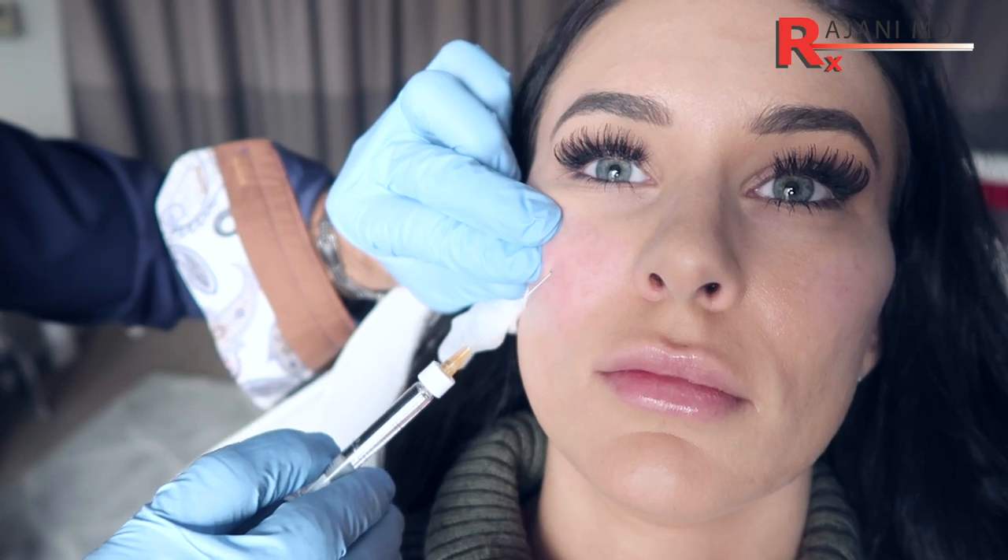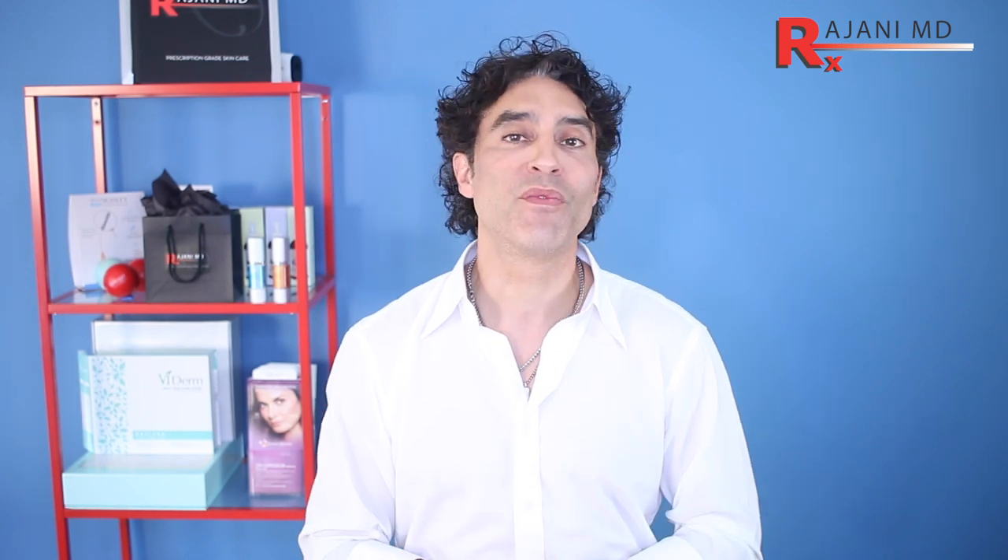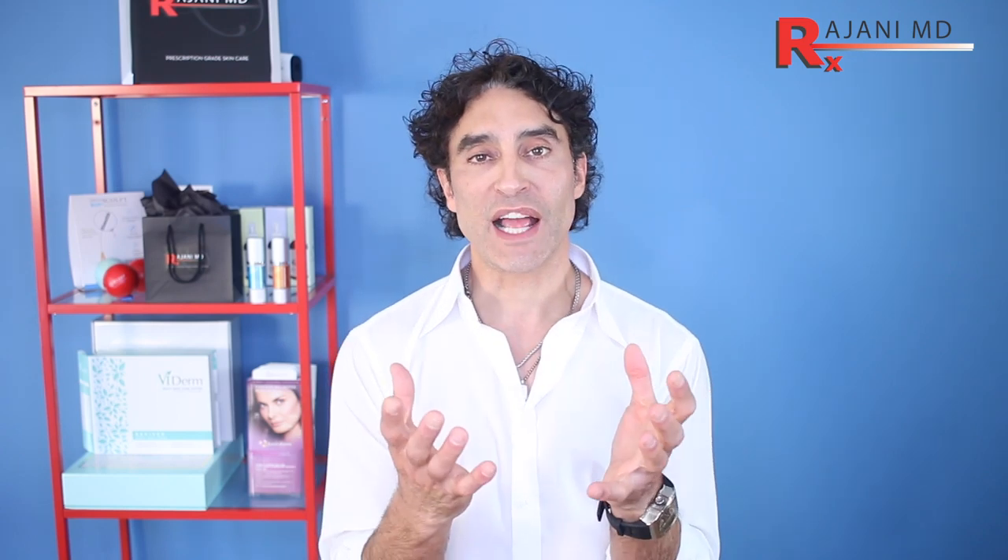In general, we want to go deeper — it avoids a lot of structures. The cannula does get to the deeper layers in the midface, unlike the temple where you can't get there because it's blunt. In the midface, because of the nature of the tissues, you see the product less, giving a better result. Think about it as placing a facial implant — really that's what we're doing with fillers: an implant that can be adjusted over time, looks natural, and can be added or subtracted as the patient desires.